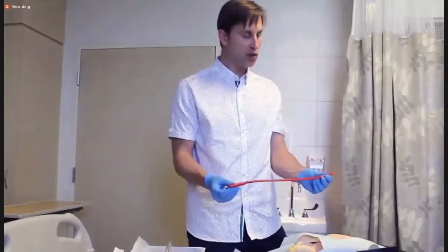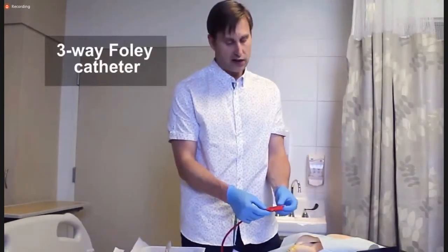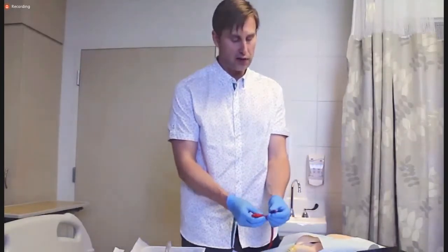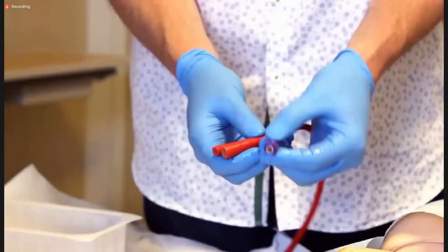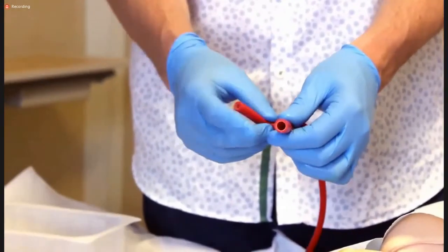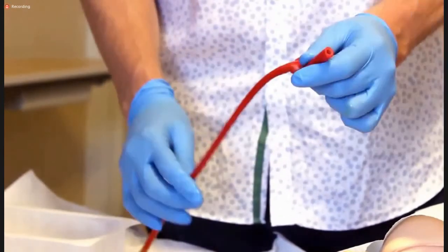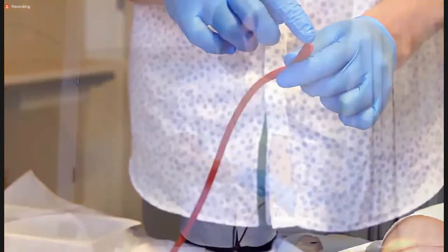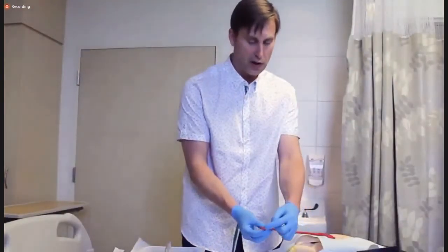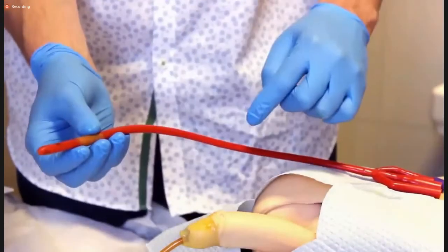Another type of catheter that we have is called a three-way Foley catheter, or three-way urethral catheter. In these instances, it's very similar. You have a balloon port, and in this case, this is purple, tells you that it's 22 French. You have a drainage port where the urine will drain from, but the key difference is this third port. And this third port allows fluid to flow in to the bladder. So you have a series of ports, one for inflow and others for the outflow.